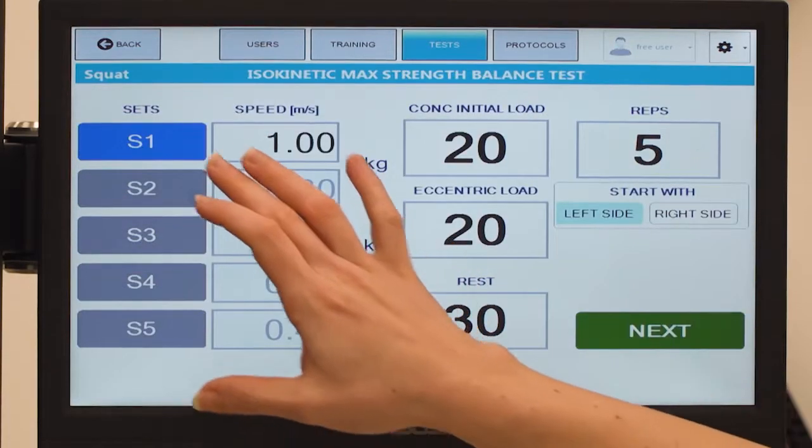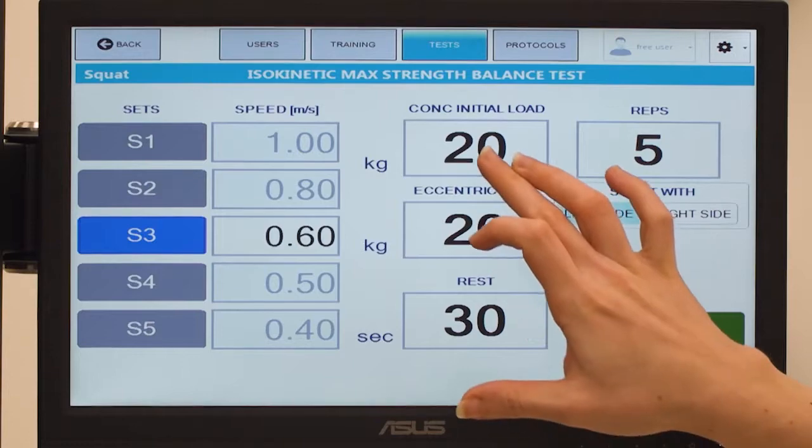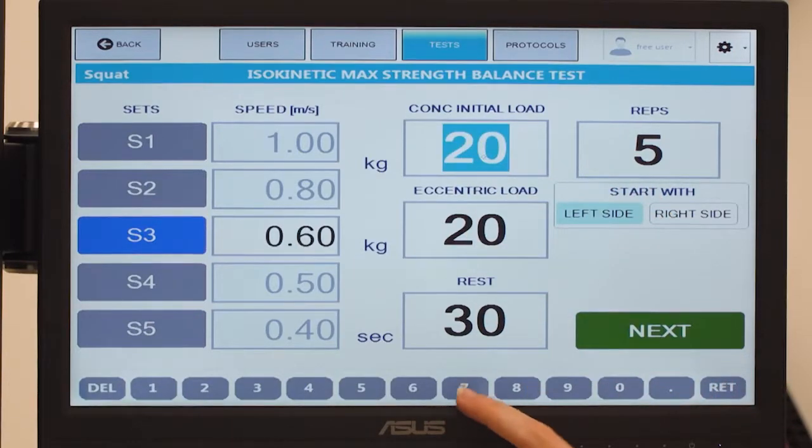The isokinetic test on Kineo is performed by choosing the isokinetic concentric max strength balance test.